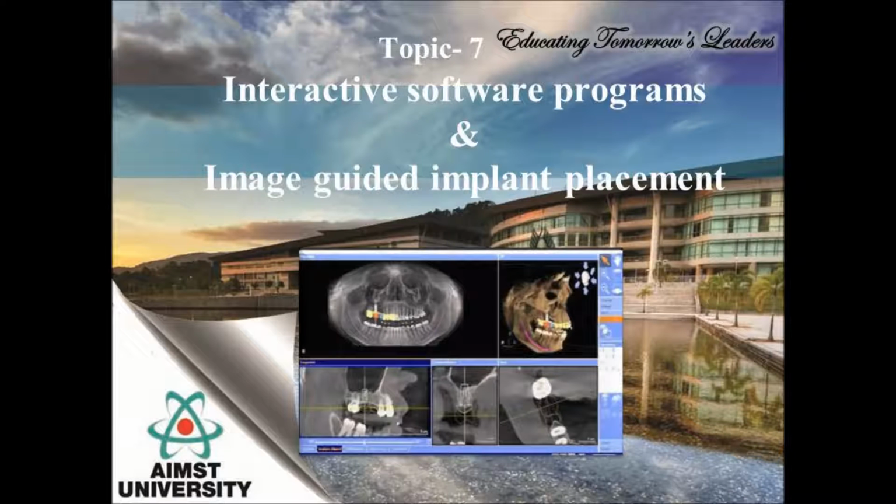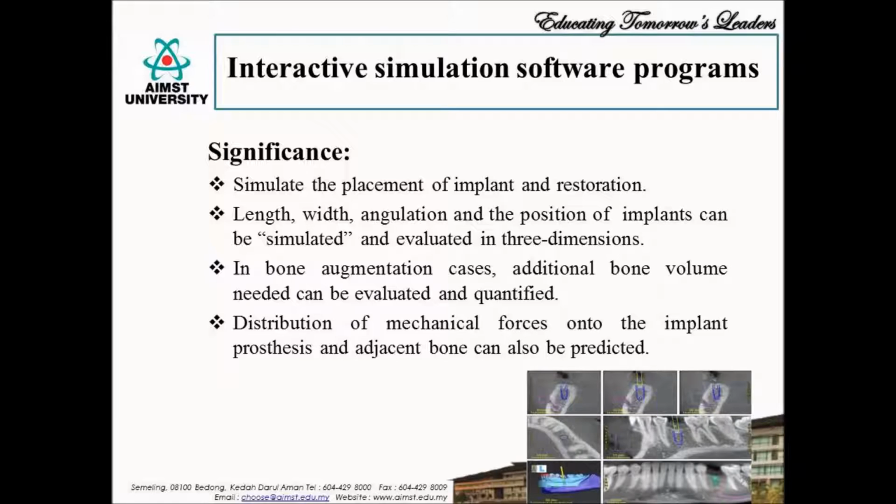Very good morning all. Today I will discuss the various software used in 3D digital imaging and image guided implant placement. Now coming to interactive simulation software programs. The most useful and valuable advantage of digital imaging is the use of these specialized software programs, which enable us to design the treatment plan through interactive communication among the implant team. So implant treatment planning is greatly enhanced by the use of these specialized software.